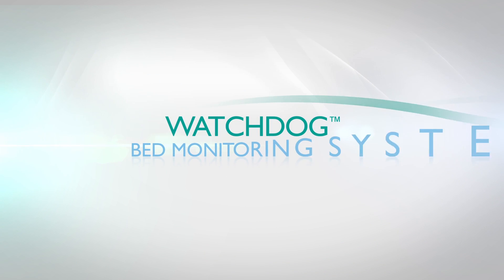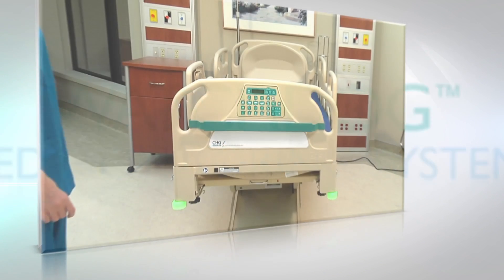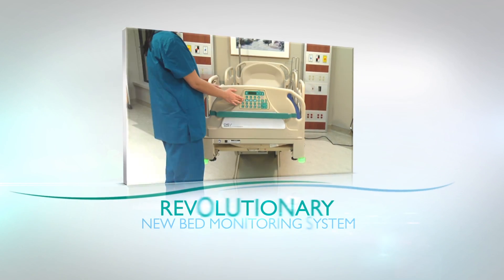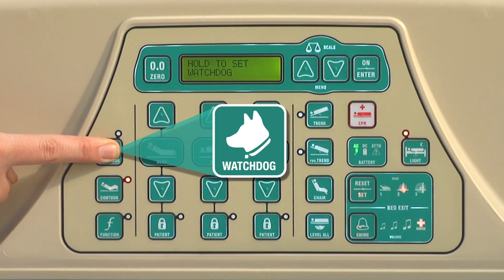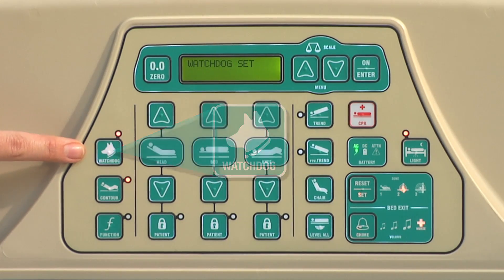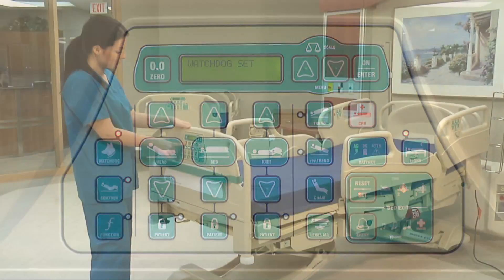Watchdog Bed Monitoring System. The Spirit Select Bed has a revolutionary new bed monitoring system called Watchdog that notifies staff of critical bed status changes with a lighted notification.